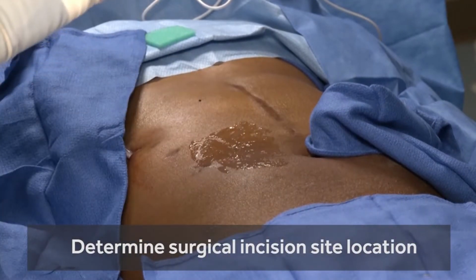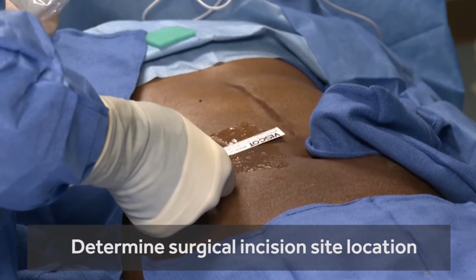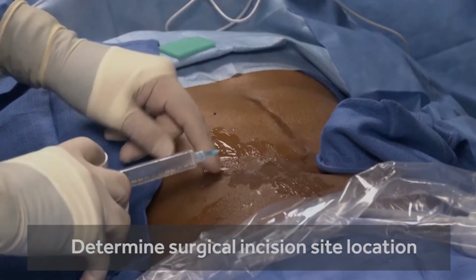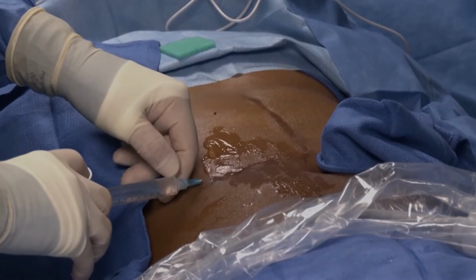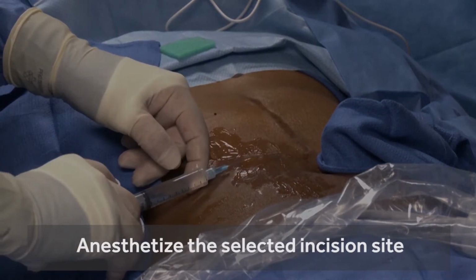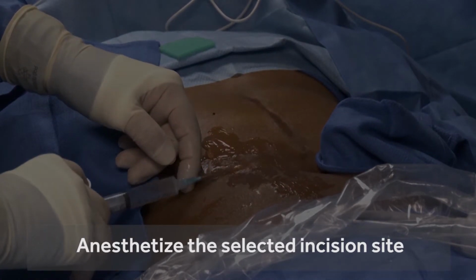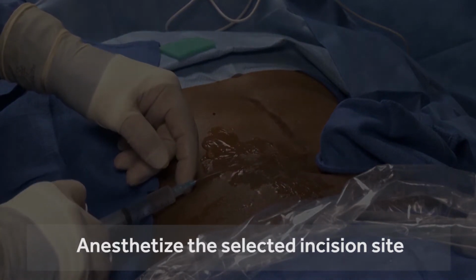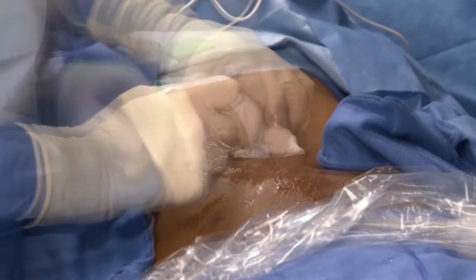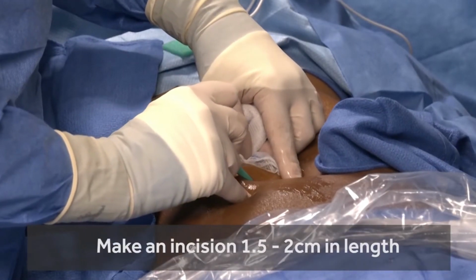As an initial step, we want to determine the surgical site, and that will depend on the patient's body habitus and the size of the catheter that you're going to be utilizing. Once chosen, we'll anesthetize the skin with lidocaine 1% in about a 1.5 to 2 centimeter linear configuration. And we want that incision to be about 2 centimeters lateral, either right or left, from the umbilicus, and about 2 centimeters above the umbilicus.